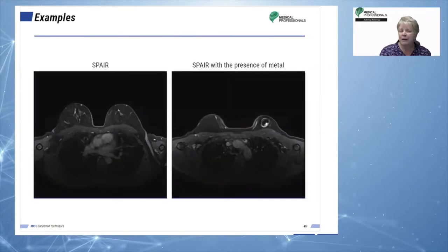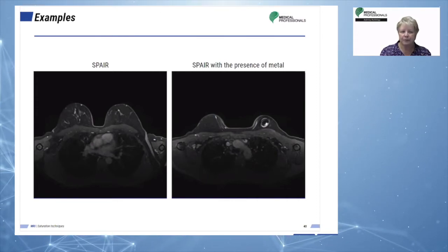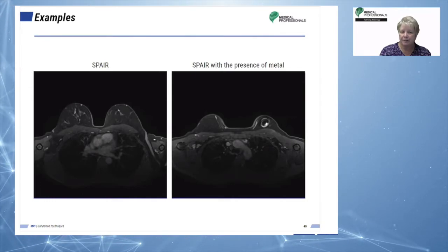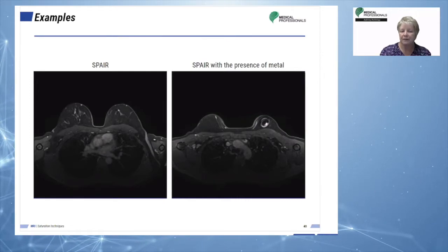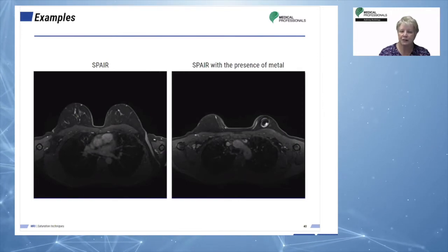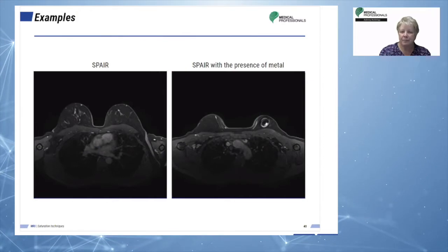Breast imaging is a great place for fat saturation due to the amount of fat in breast tissue. This is an example of a breast MRI using SPAIR. There are two reasons SPAIR is a good choice for this sequence. First, the breast often has various thicknesses between the chest wall and then out towards the nipple. So we have varying part thicknesses.